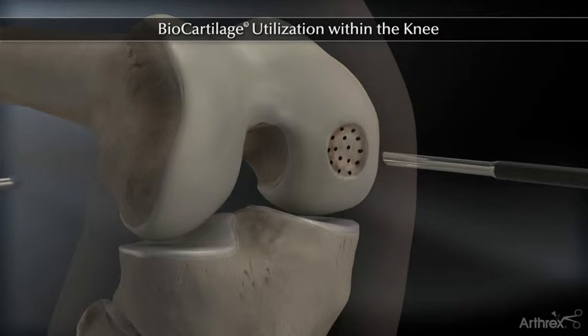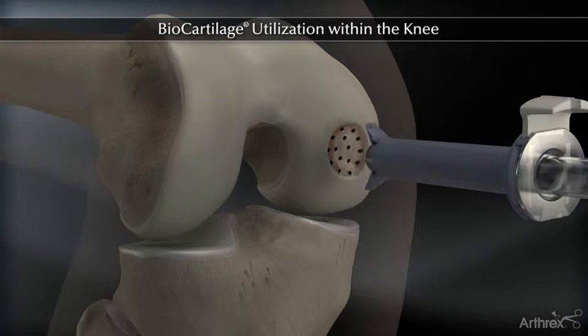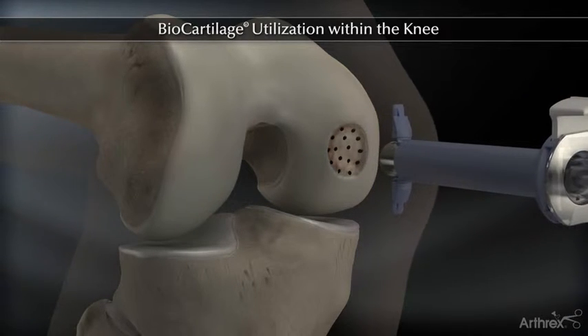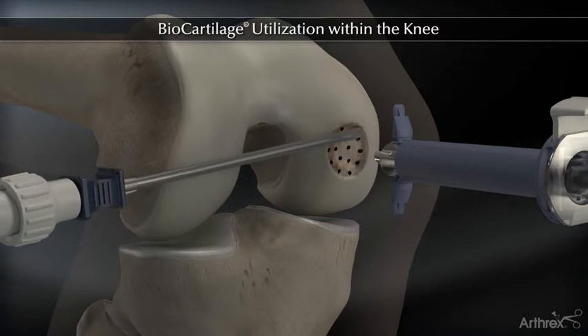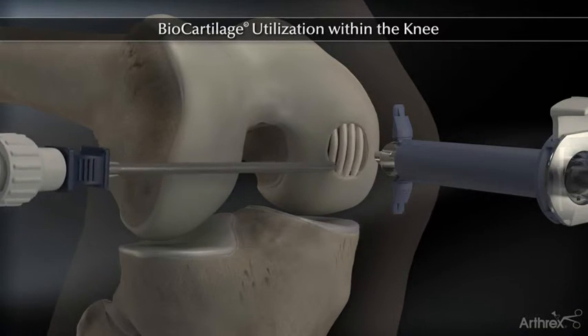The Gemini cannula allows distraction of the soft tissue, improving visualization when moving to a dry scope environment. Dry the defect thoroughly, then utilize the TUI delivery needle to deliver biocartilage into the defect.